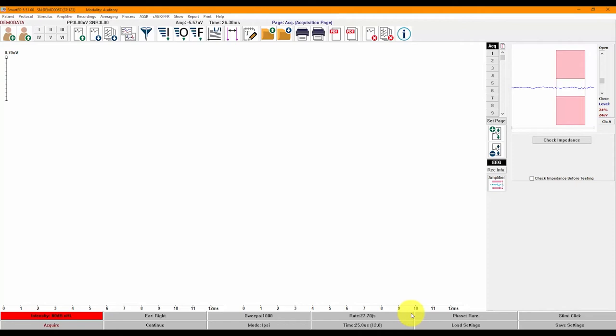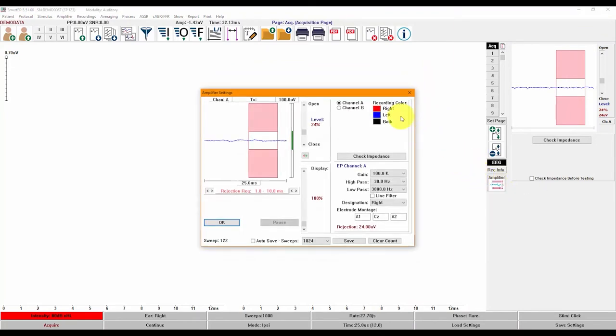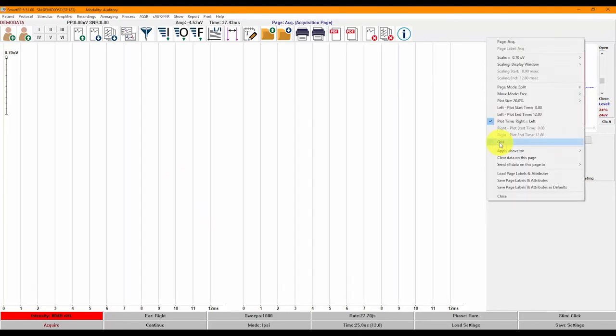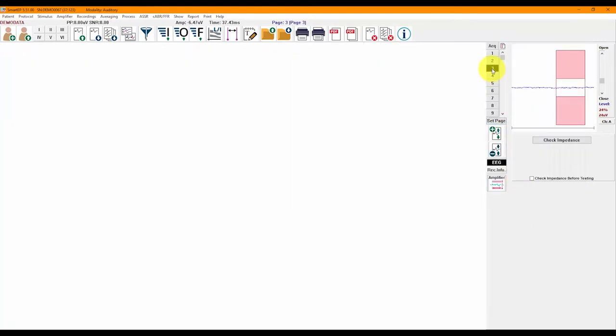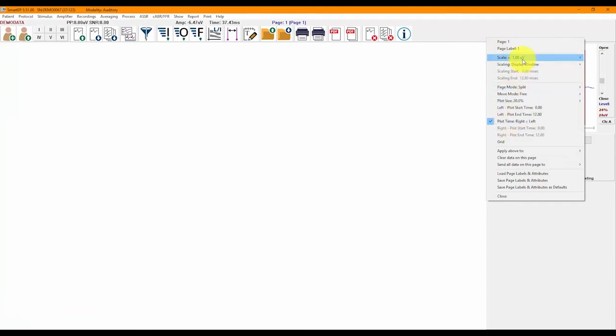A single click on Stim will open the Stimulus Generation Utility. The Amplifier button opens the Amplifier Settings window, where you can modify gain, high pass, and low pass settings, and activate the line filter. The recordings will appear in the large white space. You can activate or hide a low-profile grid by clicking on the Set Page button or on the Page Number on the right of the white space. Clicking on each page, you can also customize page attributes such as the scale, page name, and more.